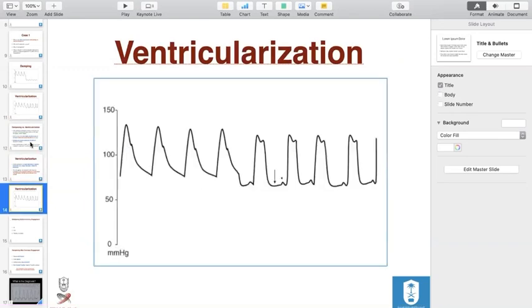So why does it happen? What happens is actually a reflection of ventricular systole. Once a contraction happens, what you see is the transmission of pressure within the ventricle into the artery, because your catheter is completely against the wall, and that's the transmission of the pressure to that.